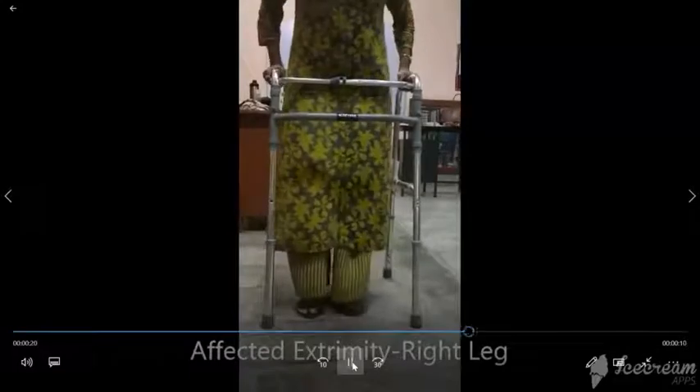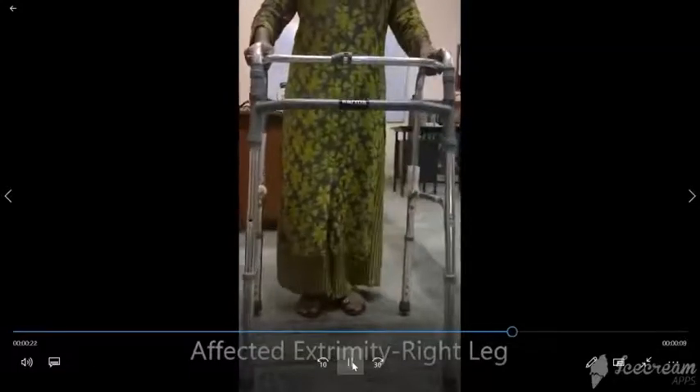Bring your stronger leg forward and keep both feet inside the frame of the walker.